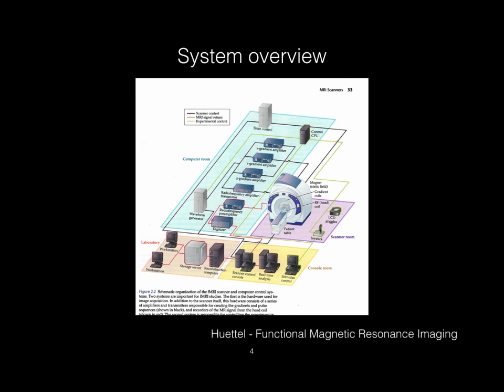This is very high power, very high fidelity electronics. We'll explain why that's needed. And then related to the imaging process are gradient amplifiers. Basically these are very high powered direct current sources that essentially let us modulate the magnetic field. And again, we'll talk about why we need that.